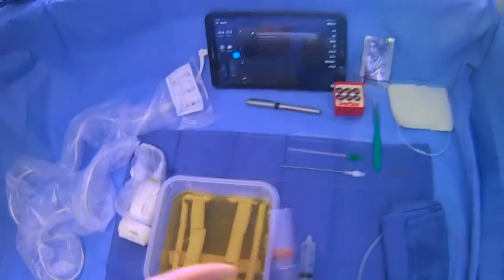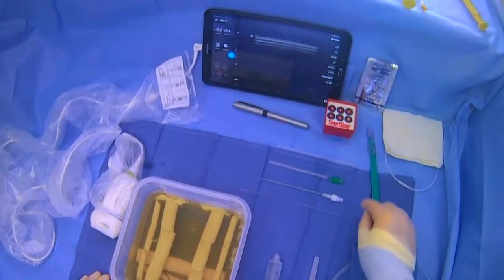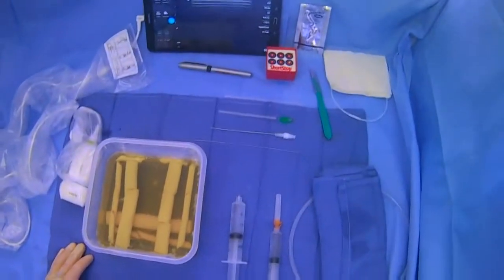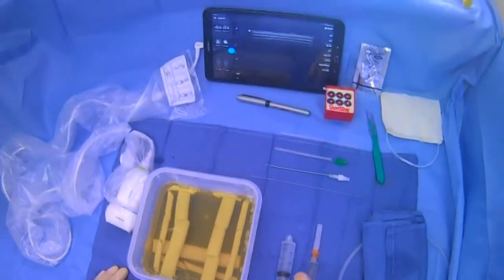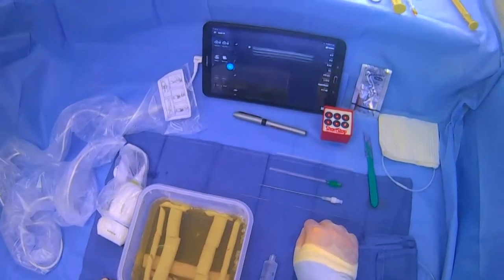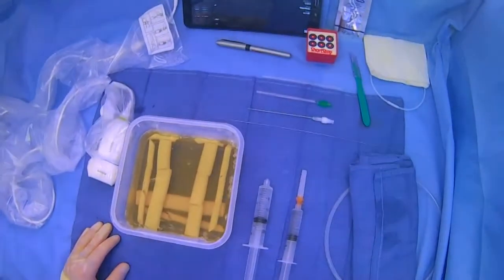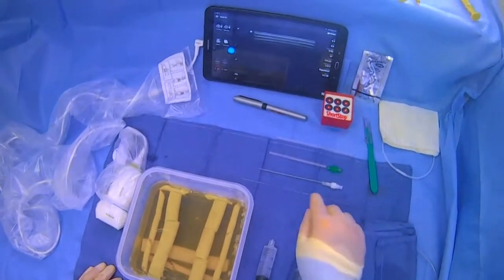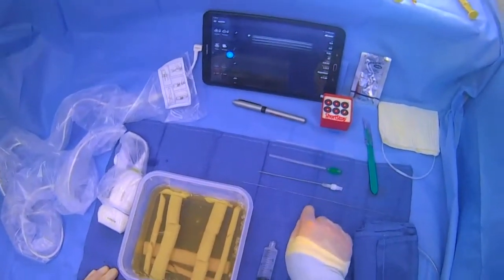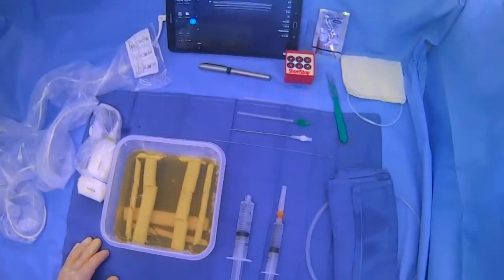While that is working, make sure your micropuncture kit is ready: you have your 21 gauge micropuncture needle flushed, your 4 French micro catheter flushed, your micro wire, and then the wire that follows — in this case an Amplatz wire. Keep in mind that once you make the puncture with the micropuncture needle, only the 0.018 inch diameter micro wire can go through it — not the Amplatz, which is 0.035 inches and too big. After puncture, put in the micro wire, then advance the micro catheter whose inner stylet only allows the micro wire through. Once you remove the stylet, you can then put in the Amplatz wire to finish.